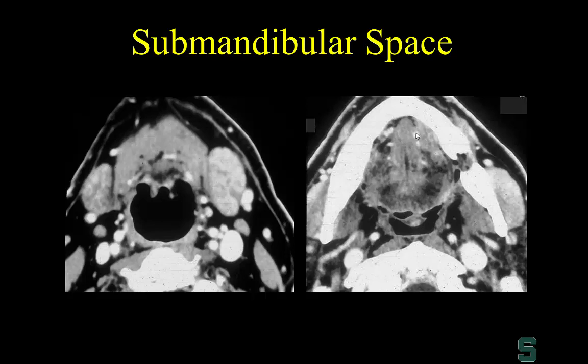Okay, so the bottom line is anytime that you have obstruction of the submandibular gland, you have to take a very close look at the sublingual space to make sure there's no stone or to make sure there's no aggressive lesion that's causing the obstruction of the gland.